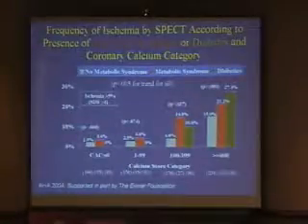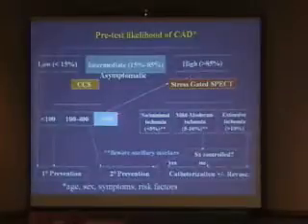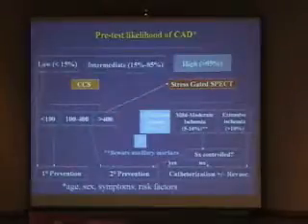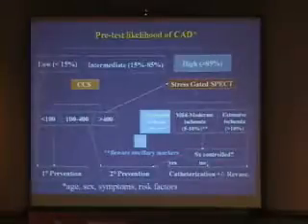So patients with the metabolic syndrome might be one of those patient groups where even in the 100 to 400 range, it might make sense to go the direction of doing a nuclear study after a coronary calcium scan score has shown either an intermediate or a high amount of calcium.